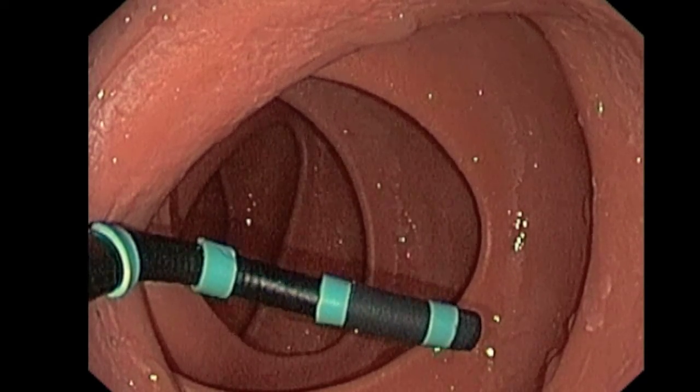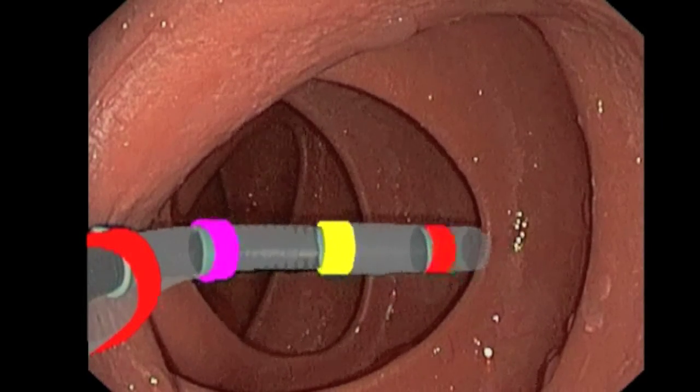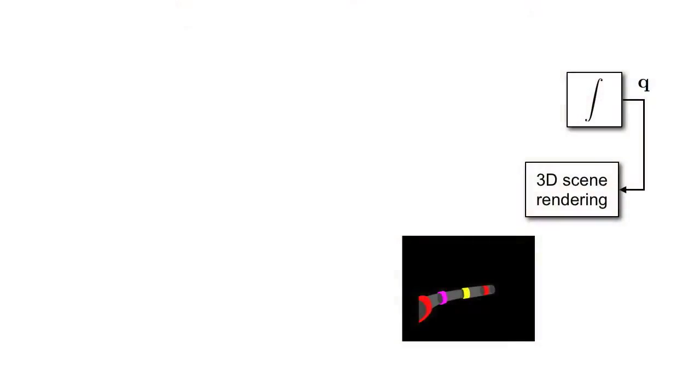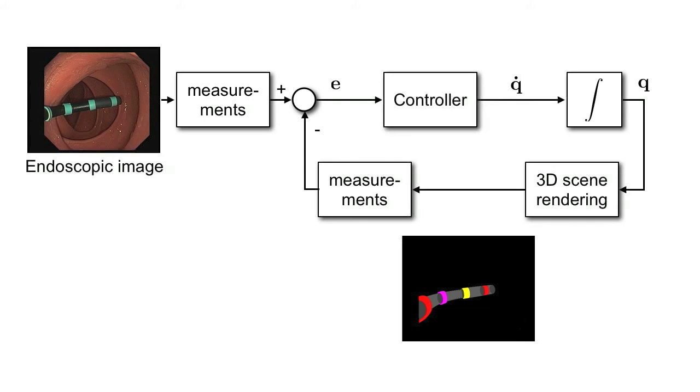We use a visual servoing-inspired approach to match a 3-dimensional rendering of the instrument to the actual observed instrument. Using the current state Q of the estimator, a 3-dimensional rendering of the instrument is created. From this rendering, the centroids of the markers are measured. These are compared to the centroids of the markers in the endoscopic image, resulting in an error E. The controller computes the required state change Q dot using the pseudo-inverse of the interaction matrix, which describes the relation between the change of state Q and the change of error E.